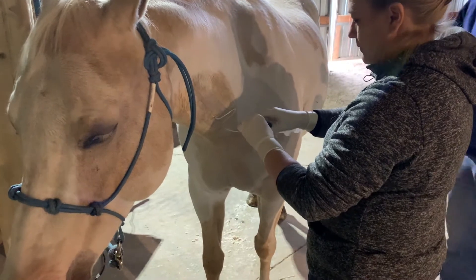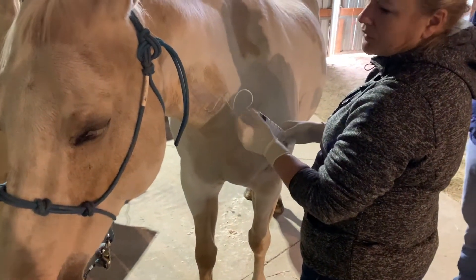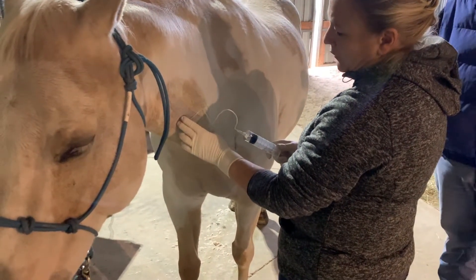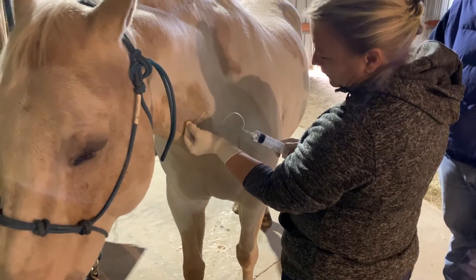Dr. Wilson, what did you use to sedate the horse again? I used Dormosedan and Torbugesic — or butorphanol. What I like about that is that the Torb keeps their feet on the ground, and this horse is a little bit of a kicker.